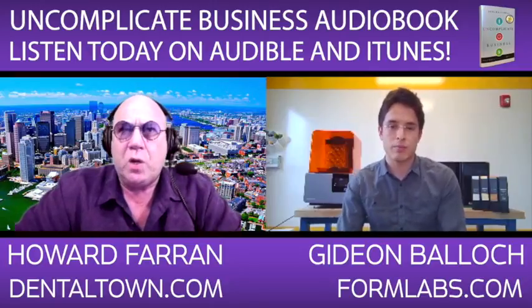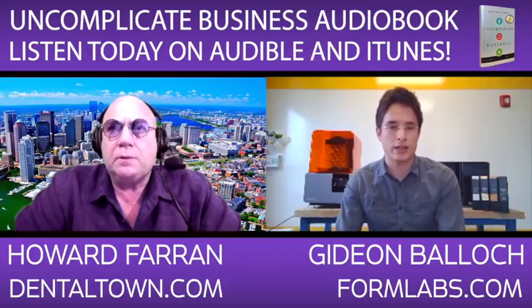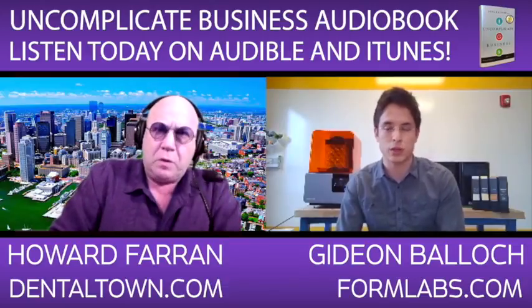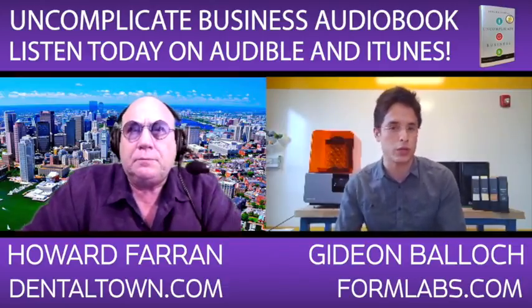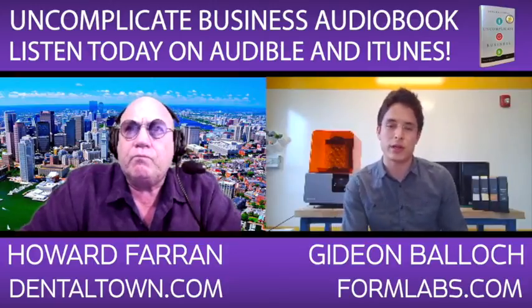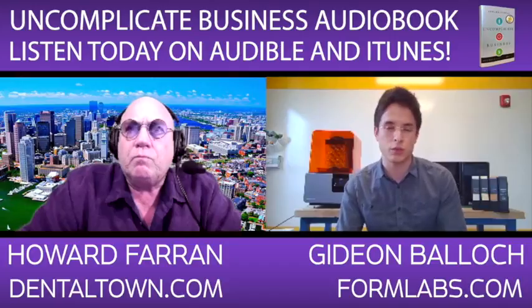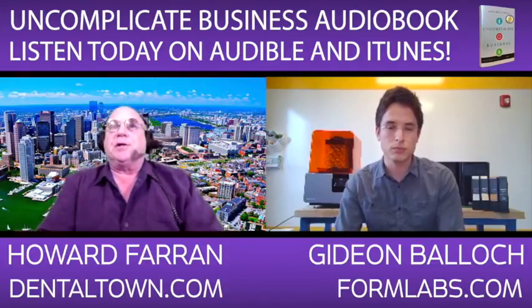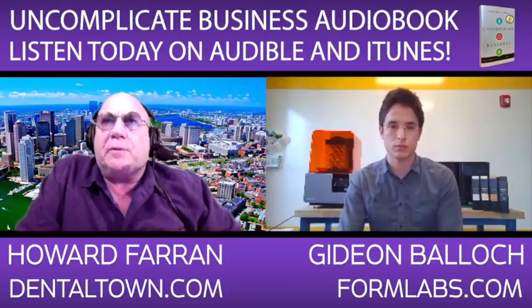At the same time, building high-end aesthetic, final restorations is a place where CNC milling is doing a great job right now and is going to continue to do a great job for the near future. And that's a space where CNC mills are really going to still beat out 3D printers for the time being. Yeah, because you'll have to get a material to print that'll be as hard as zirconium, right?